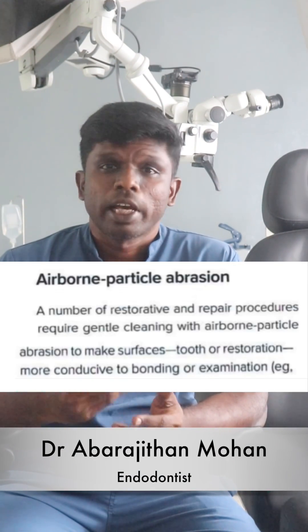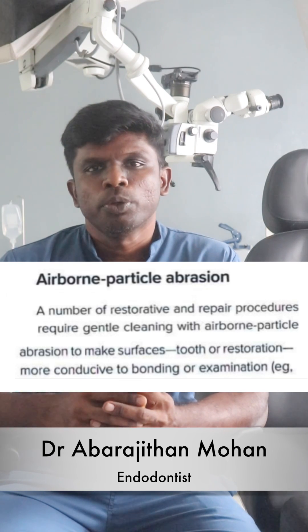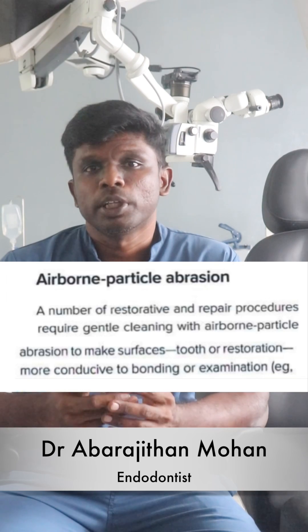Hello friends, we all know that air abrasion plays a very important role in adhesive dentistry. Today I am going to show you how air abrasion can be performed using a simple and economical air polisher.